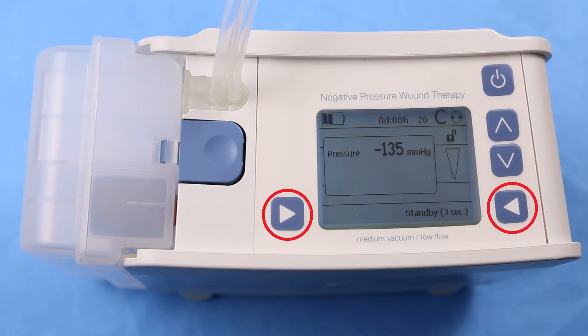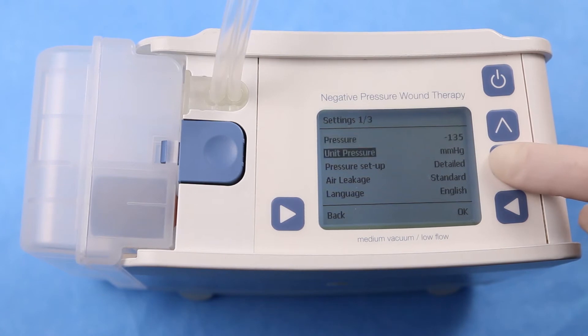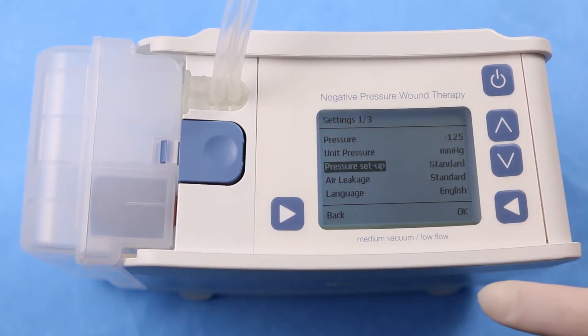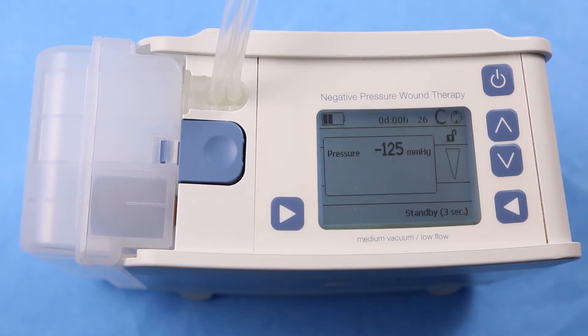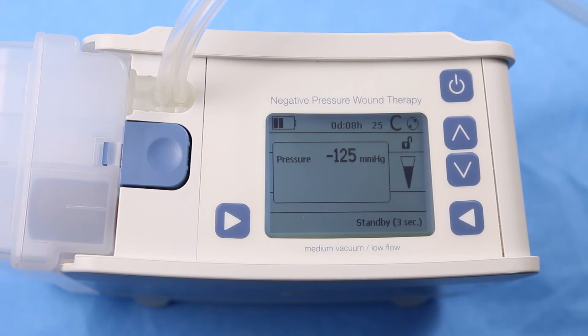While in Administrative Mode, press both the left and right bottom buttons at the same time. To switch between standard and detailed pressure modes, select Pressure Setup and press OK, then use the up or down button to switch from Standard to Detailed and press OK once more. The pressure can now be changed in increments of 5 millimeters of mercury. If the pressure is not confirmed, the pump will revert back to the original pressure setting. One minute after the last button is pressed, the device switches into Patient Mode automatically and the display is locked.